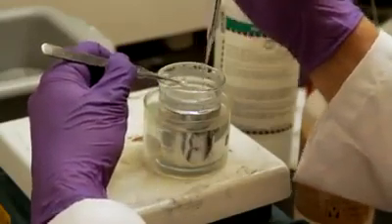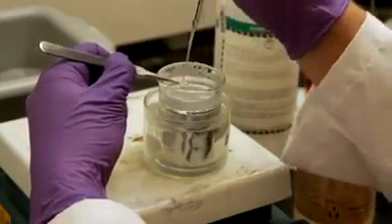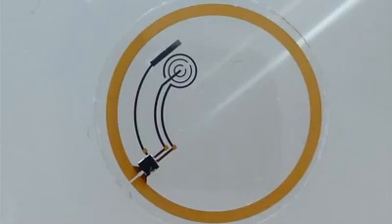So we've been able to build glucose sensors that can be incorporated into flexible polymer substrates. We have been able also to show we can make very small radio and control circuitry that can fit on a contact lens and can interface with that sensor and send out the information that the sensor has collected wirelessly to the outside world. Here's an example on a flat surface.